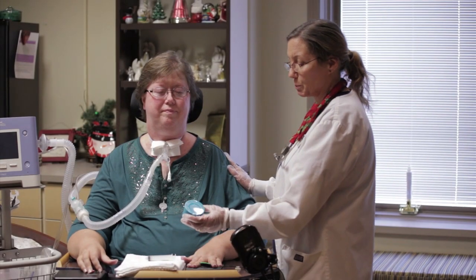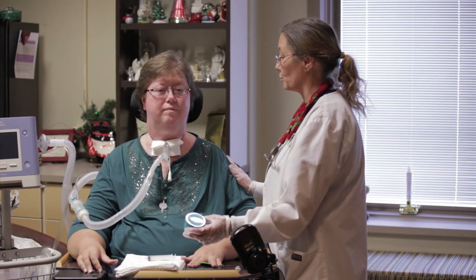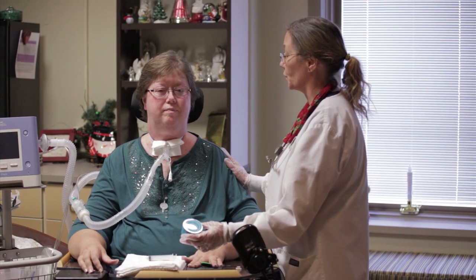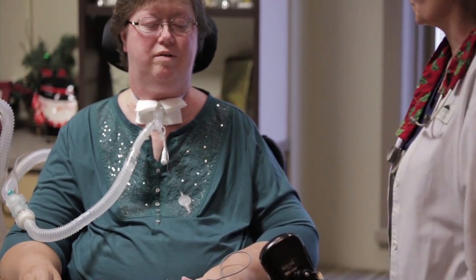This particular device is the Passy Muir speaking valve. It's a one-way valve that we're going to apply in line on your ventilator circuit, and it will help you to get your voice back. I'm going to get a beginning set of vitals on you — I need to know what your respiration rate, heart rate, and saturation rate are, so I'm going to monitor that pre and post to make sure everything is going okay.